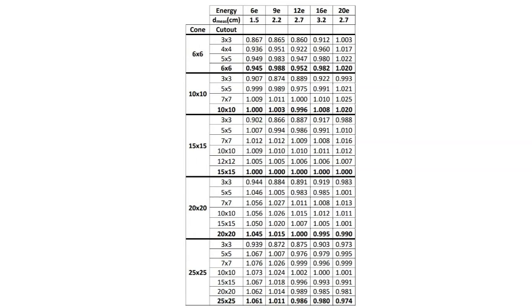And so in cases where the lesion is really small, it might be good to use an orthovoltage machine, which back in the day was pretty common, but are actually pretty rare nowadays. But I just wanted to point out that the electron output factor is really difficult to quantify for fields that are smaller than 3 by 3.